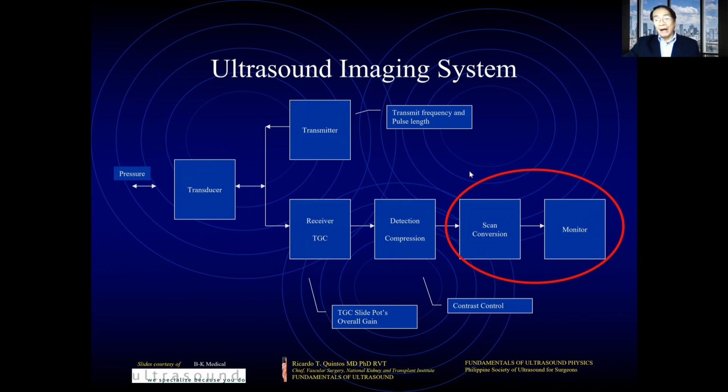So finally, we come now to the final component, which is the conversion of the electrical energy into light energy so that we can now see what the ultrasound echoes have been picked up.